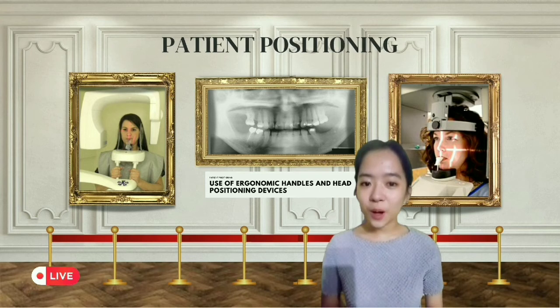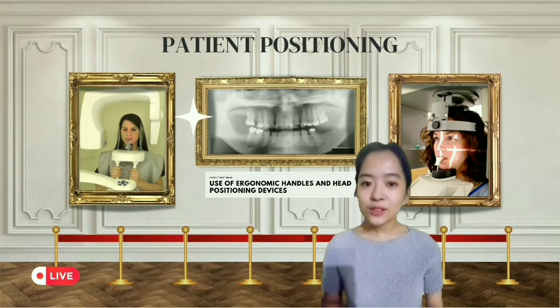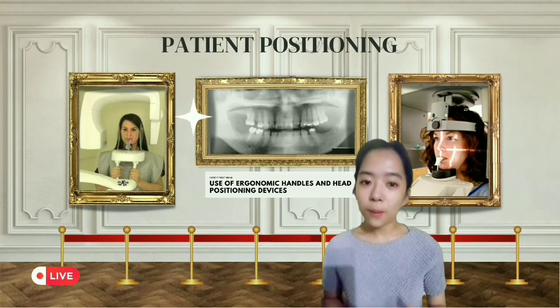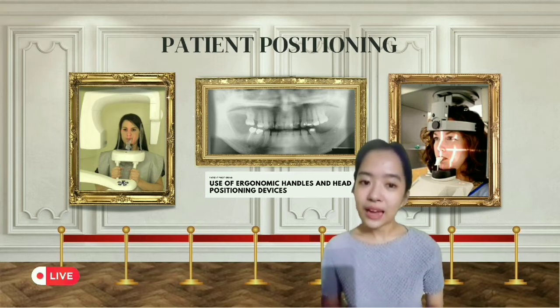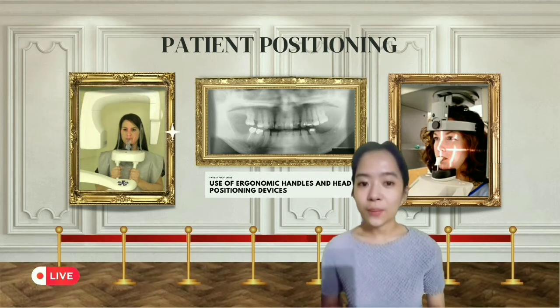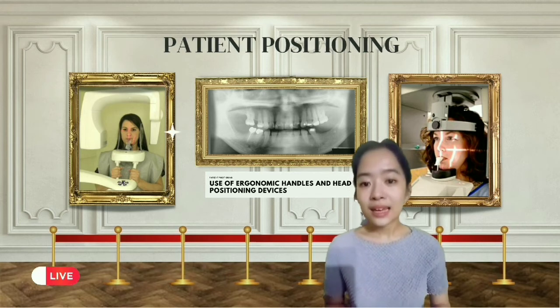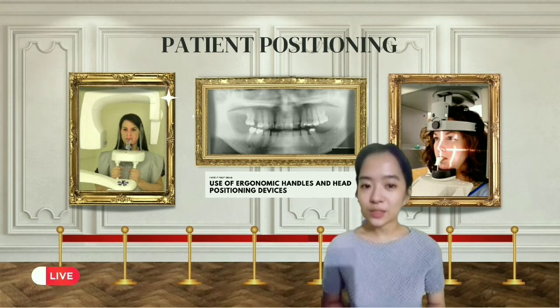And here we are. We have now reached the proper patient positioning section in the Panoramic Radiography Gallery. To obtain diagnostically useful panoramic radiographs, it is extremely important to prepare patients properly and comfortably because of the length of time needed to acquire the panoramic image. In these photographs, we see the use of ergonomic handles and head positioning devices which allow for patient comfort while maintaining the correct position, and may allow for the patient to stand, sit, or use a wheelchair during exposure.